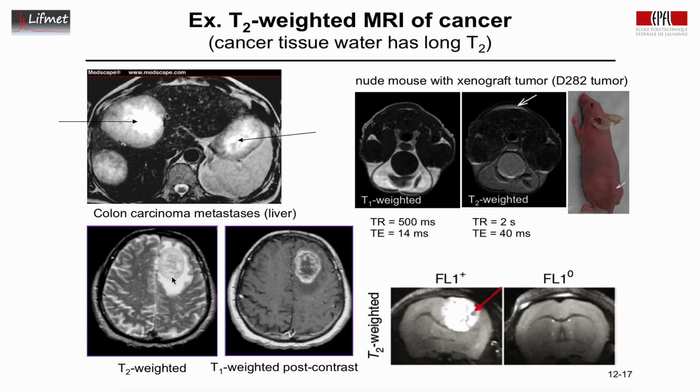And what often is done is the application of contrast agents, which depict in the brain a breakdown of the blood-brain barrier or vasculature. And this is now the same patient here, a T1 weighted image after the application of a contrast agent. And that bears now the question on what are MRI contrast agents, which we'll discuss next.